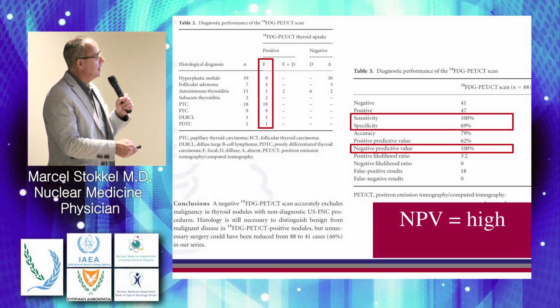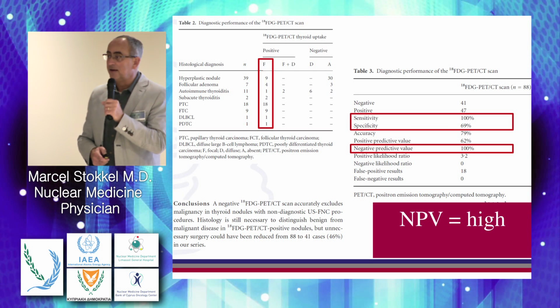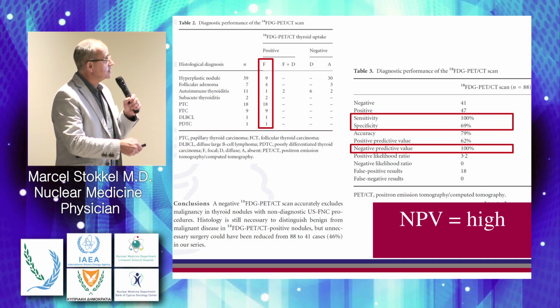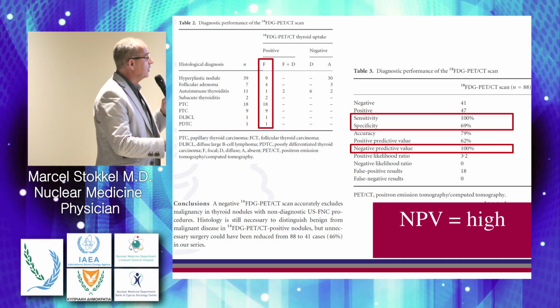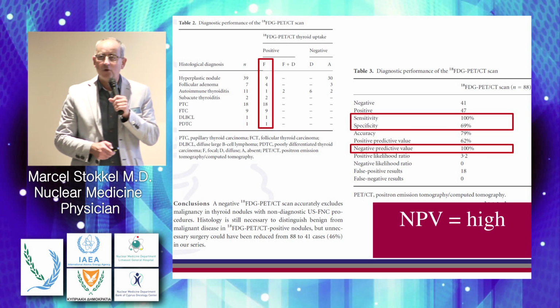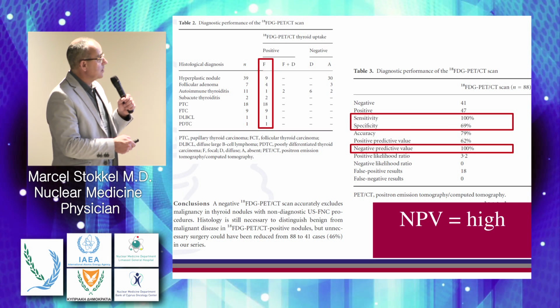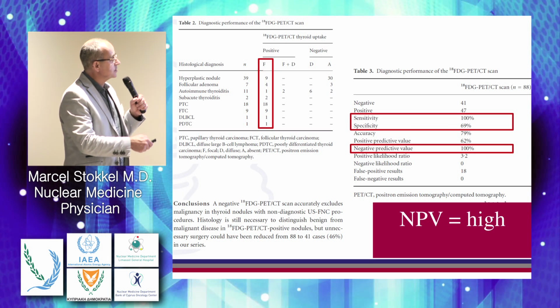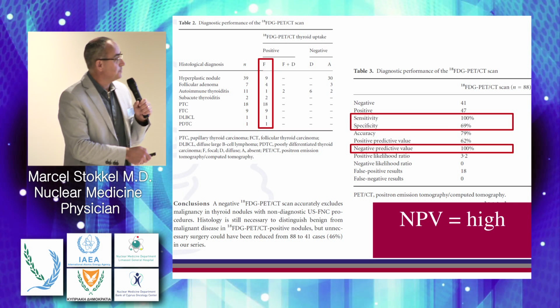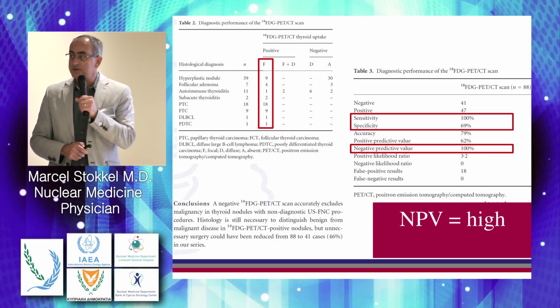And in this case, 18 patients with focally increased uptake had papillary thyroid cancer, and 9 patients with focally increased uptake had a follicular cancer. So what you can see is that the sensitivity of FDG PET is really, really high. The problem is, however, due to the benign entities, specificity is really disappointing, in a range of 60 to 70%.